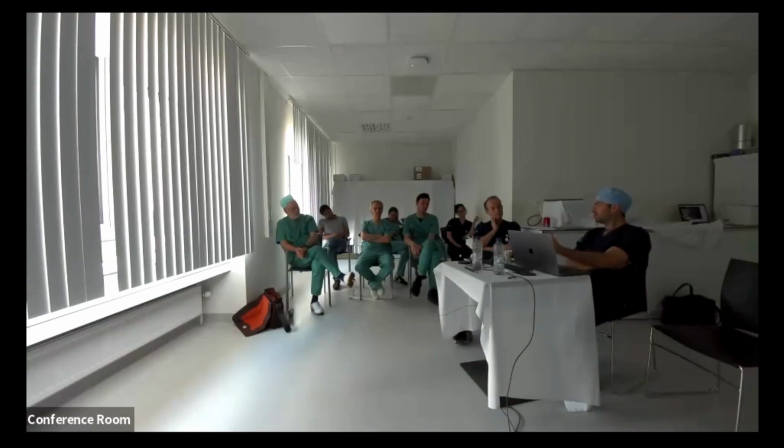Here is the thing I suggest. It could make you worse. This might happen. It could make you better. This might happen. What do you think? And that's actually at the end of the day what it is, a conversation with a patient about it if it's not clear. But I haven't had that situation very often. Normally the FLIP is very positive if the patient has got achalasia.